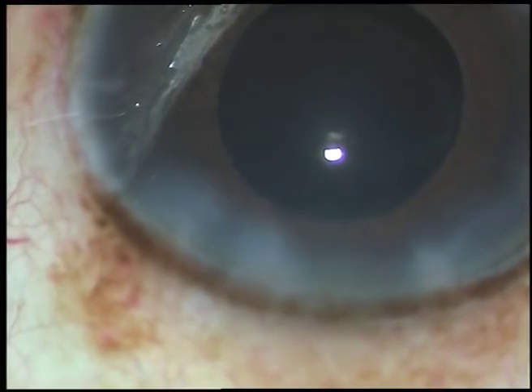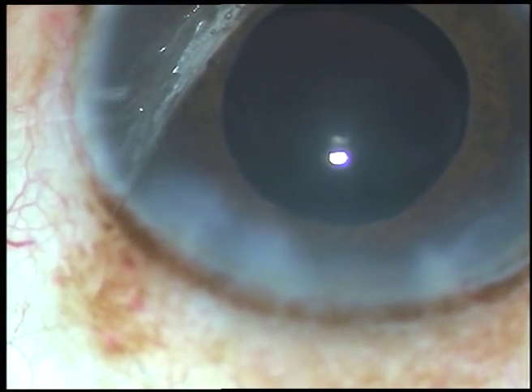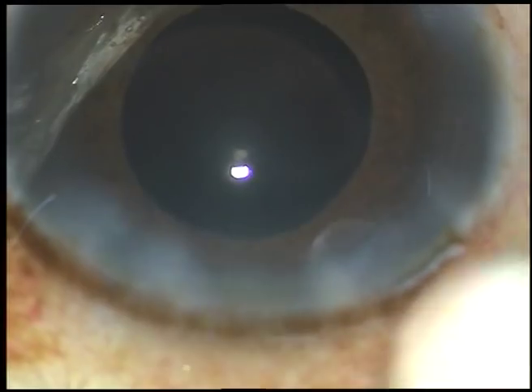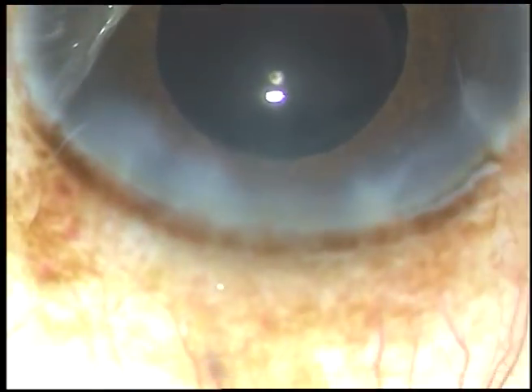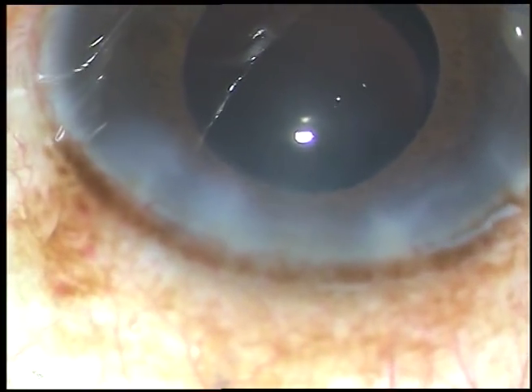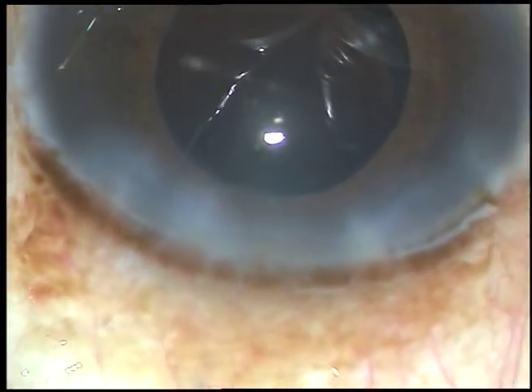The anterior chamber is formed and the case is concluded. Thank you very much. Hope this video will help you in developing your surgical skills. All the wounds are checked — there should not be any leakage. And the case is concluded.